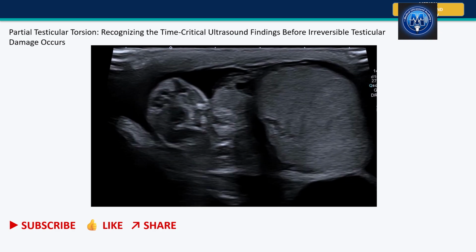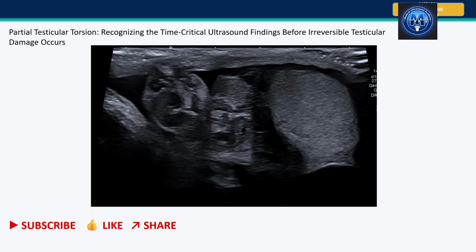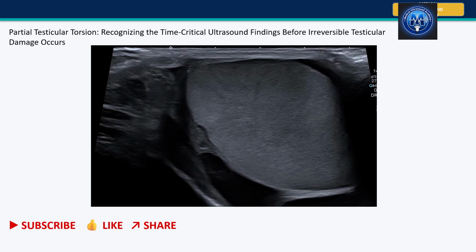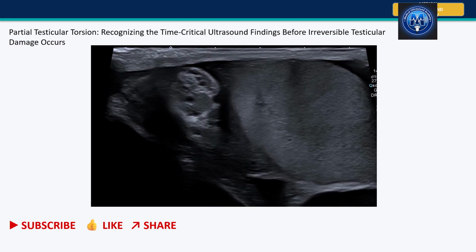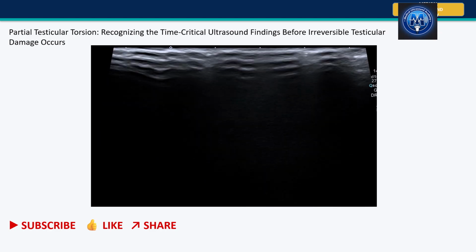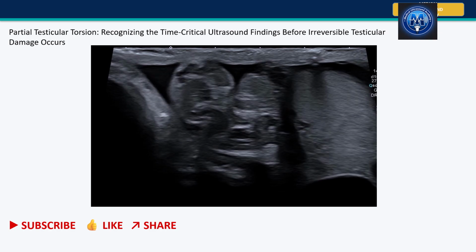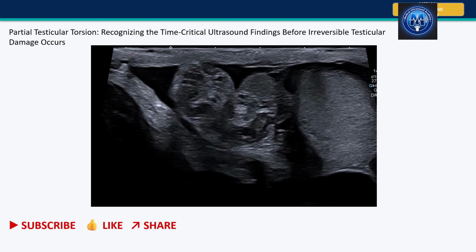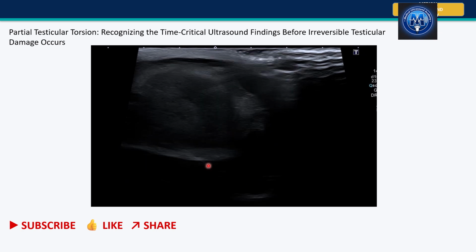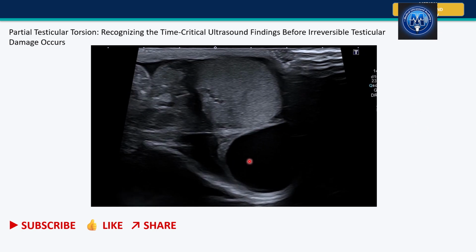There are also good moments where we can have partial torsion, and then the testicle just goes back to its normal position on its own. But we don't take chances. Once we see a torsion, the patient has to go to theater, and then detorsion has to be done. We don't need to take chances.